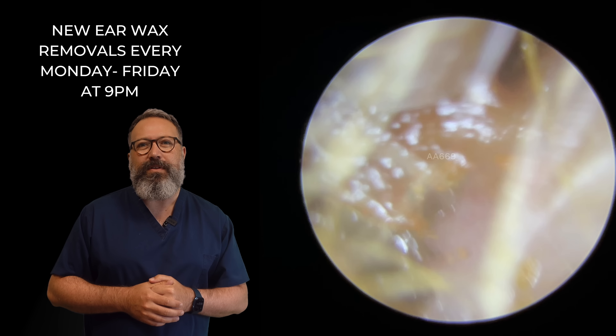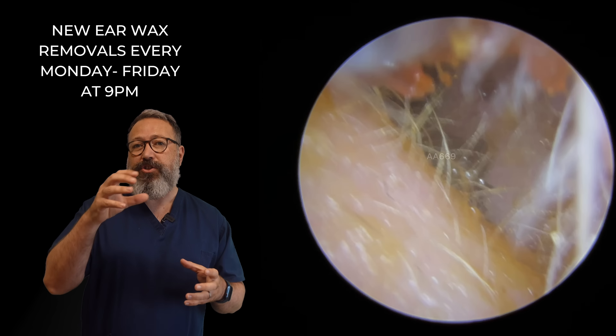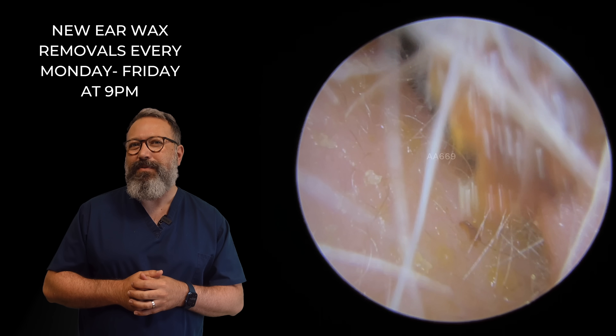How are we looking there? A little bit just at the entrance. So you can see these tiny pieces have broken away off this main plug, just inside the entrance to the canal. So we're just going to start to remove those thinner pieces. There's a lot of those little tiny pieces to take away.